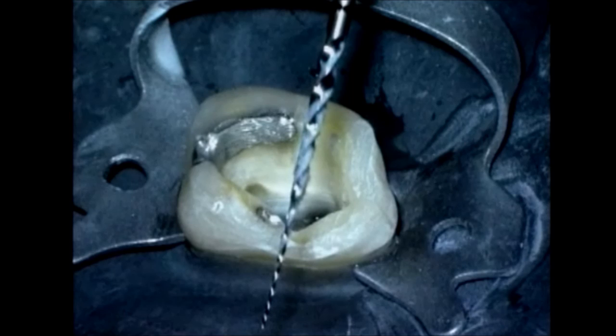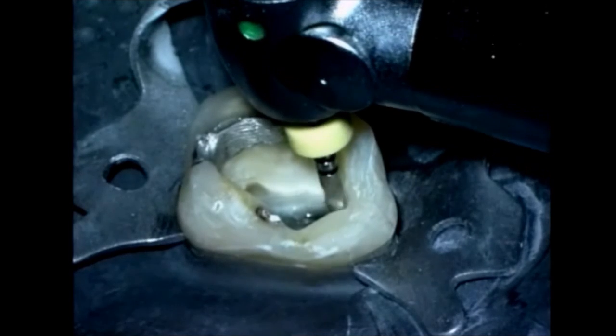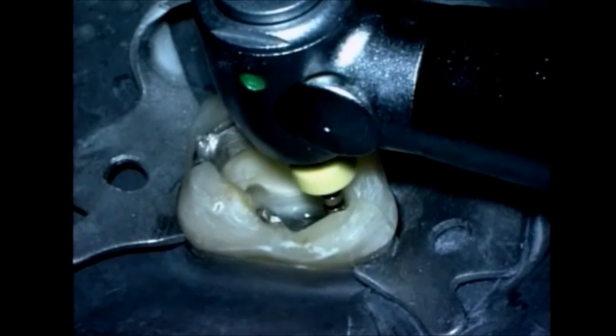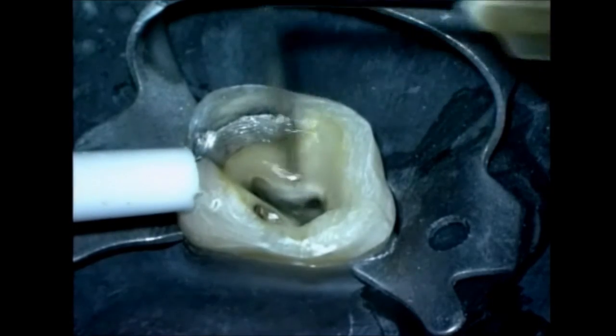Following Shaper 1, we can use either Shaper X or Shaper 2. In this instance, I will use Shaper 2 with the white identification ring, since the handles of the 10 and 15 files were on axis. Let the instrument float into the canal. I like to use the pencil lead analogy. Push no harder than you would when writing with a pencil without breaking the lead. When we've achieved the level where Shaper 1 went, the instrument is immediately withdrawn.